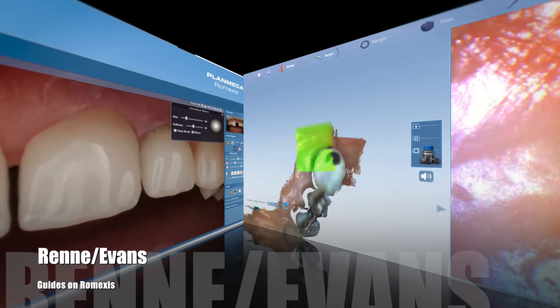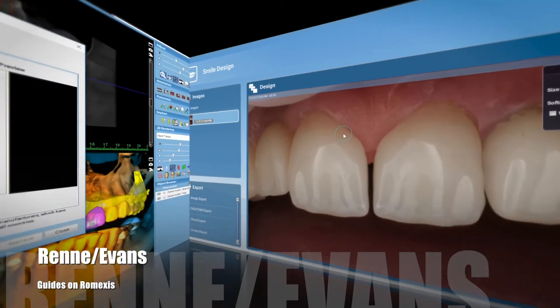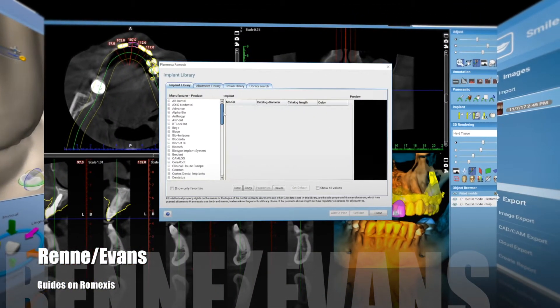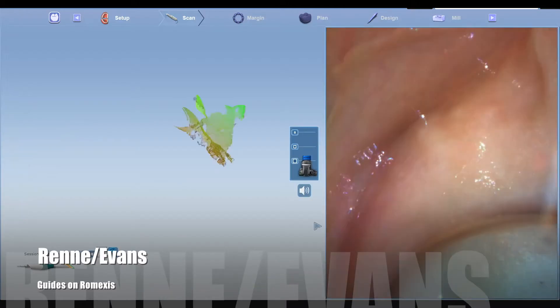All right guys, let's go over this little Emerald guide, Romexis case. We're going to go through the scanning, the smile design, merging with CBCT data, and then ultimately printing of the surgical guide. So first, let's start with scanning.